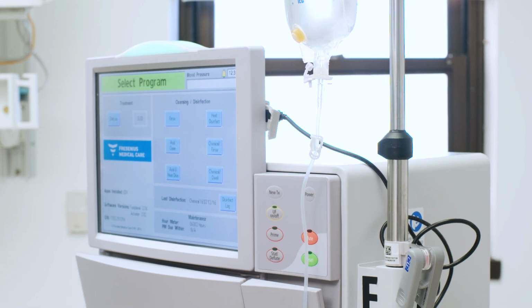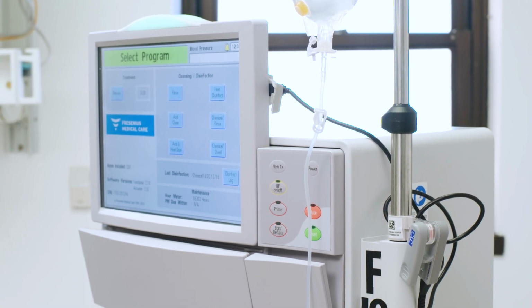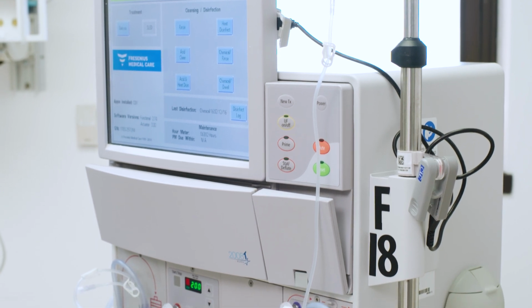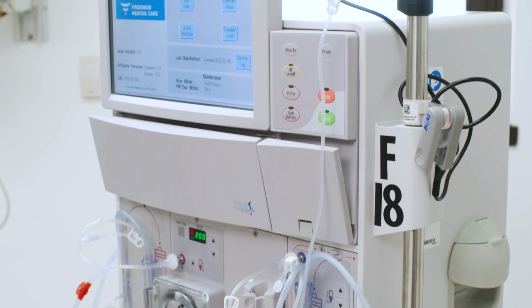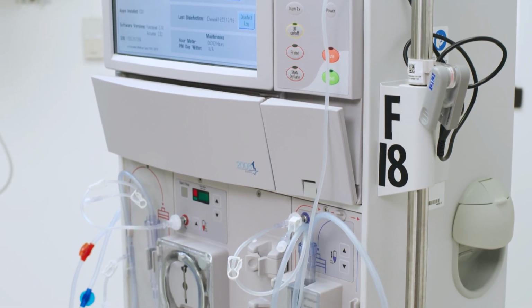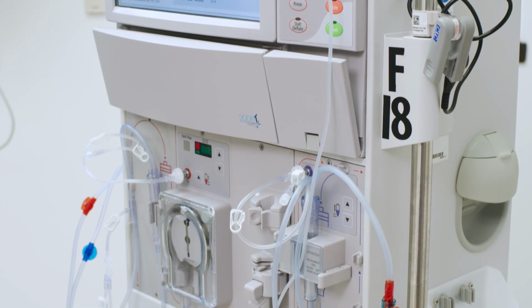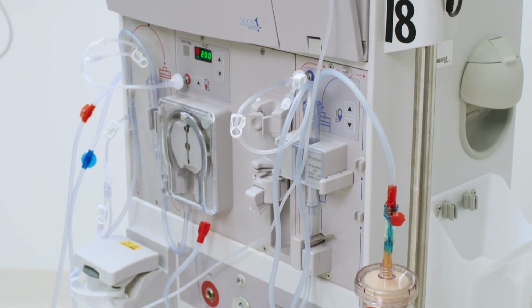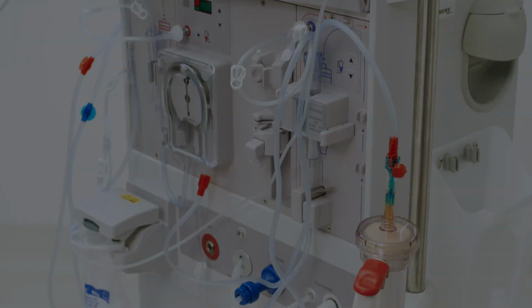In addition to regular testing, the dialysis machine's internal circuits should be cleaned and disinfected on a routine basis per current CMS and AAMI guidelines and the manufacturer's recommendations for use. And if a dialysis machine does not have an option for heat disinfection, make sure to disinfect the inlet line to reduce biofilm.